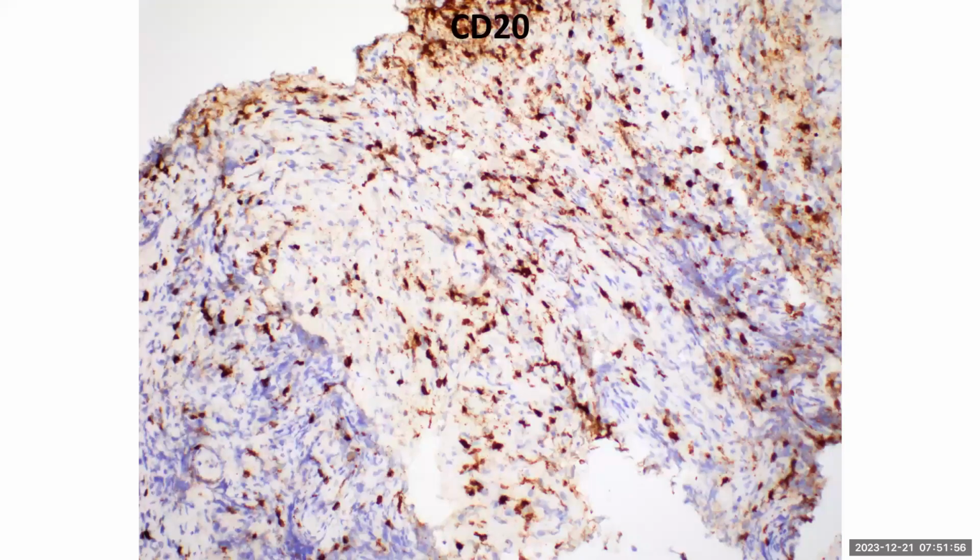So now you can see that the CD20, which is a B cell marker, is diffusely positive in these cells. That is unusual in an inflammatory environment because inflammatory cells are typically T cells and macrophages. We're looking at here a diffuse B cell infiltration. So that definitely is speaking for lymphoma or an atypical lymphoid infiltrate, which may turn out to be lymphoma by molecular means. Next.